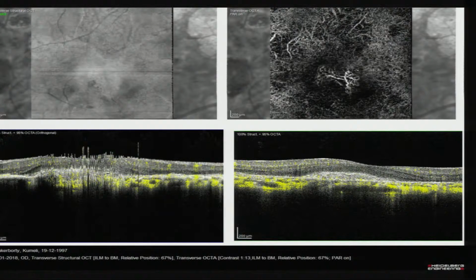Just want to understand how a subscar net causes metamorphopsia. The scar is underneath the retinal layers, and there's no fluid in your pictures. So how is the metamorphopsia happening in the photoreceptors? Where is the fluid coming into the tissues, or we cannot see it?